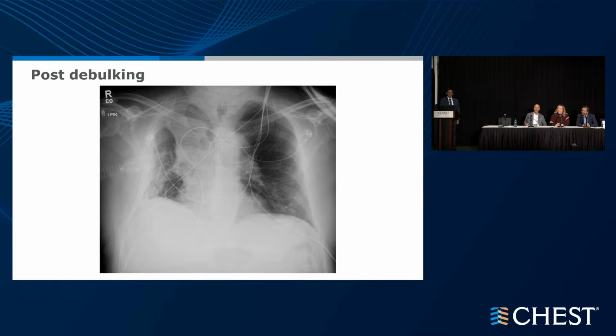Absolutely. Why no thermal therapy? Which one? I said, why no thermal therapy? Thermal, you mean like PDT, photodynamic? Thermal, so. Oh, yeah, I think I would always, because there needed to be hemostasis. I mean, there was definitely oozing. And so I think I would use a laser or argon plasma. Those, I would probably choose one of the two of those.